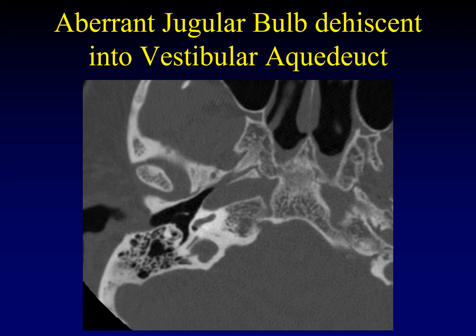Another way to get pulsatile tinnitus is to have an aberrant jugular bulb that is dehiscent into the vestibular aqueduct. This line represents the vestibular aqueduct, and you can see there is no bony plate between the vestibular aqueduct and the high-riding jugular bulb — a potential source of pulsatile tinnitus.